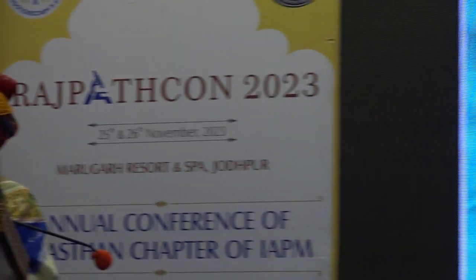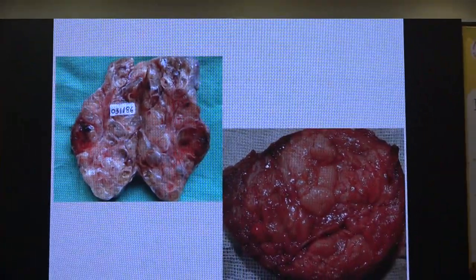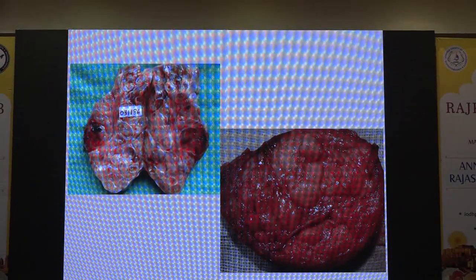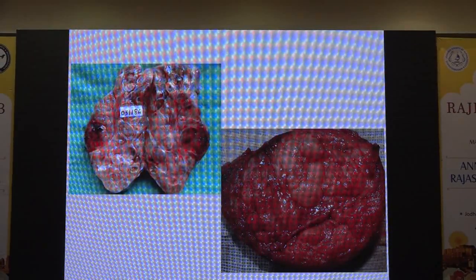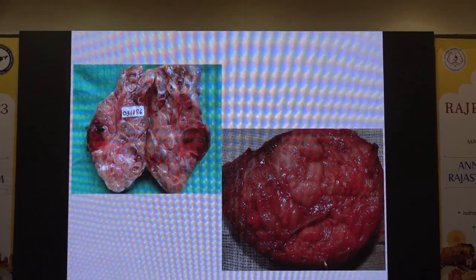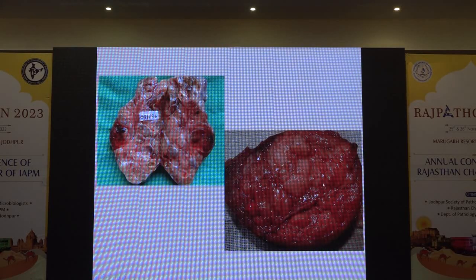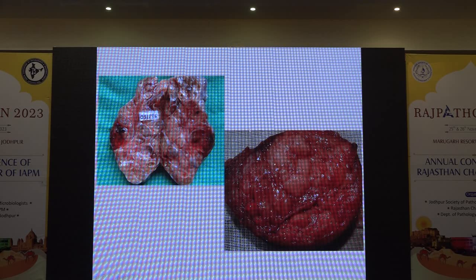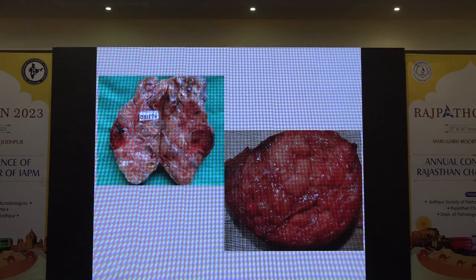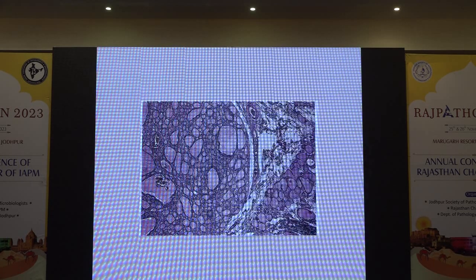So they are actually benign, but because of the nature of these nodules, they have put them into this category, that is follicular nodular disease. So these are the examples. This is how these nodules are seen here. You can see, for the postgraduates, they are nodular. So these can be adenomatous or adenomatoid nodules, and here well circumscribed with a pseudo-condensation of a capsule, but they are not, since it is just a multinodular goiter, but you have to say it is a follicular nodular disease.